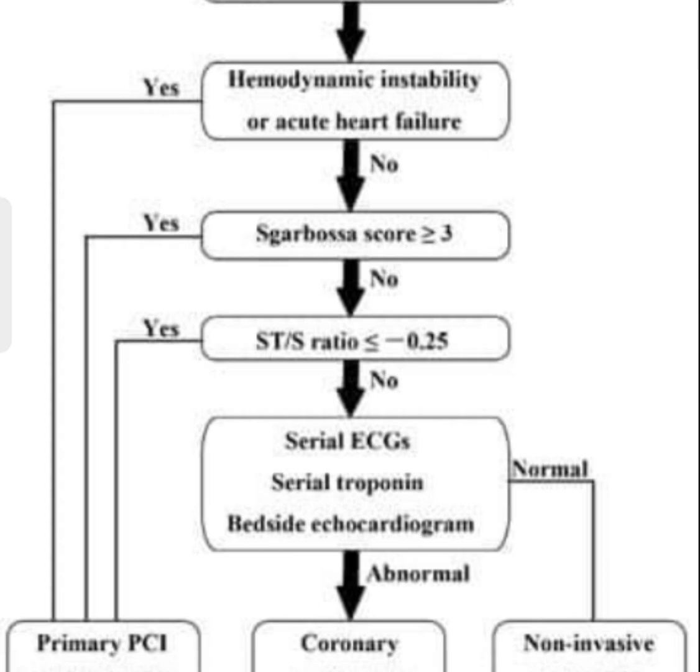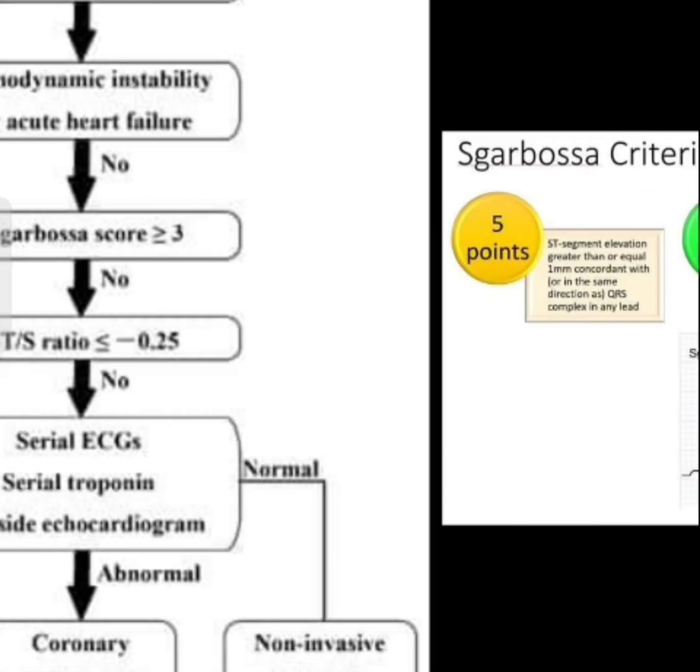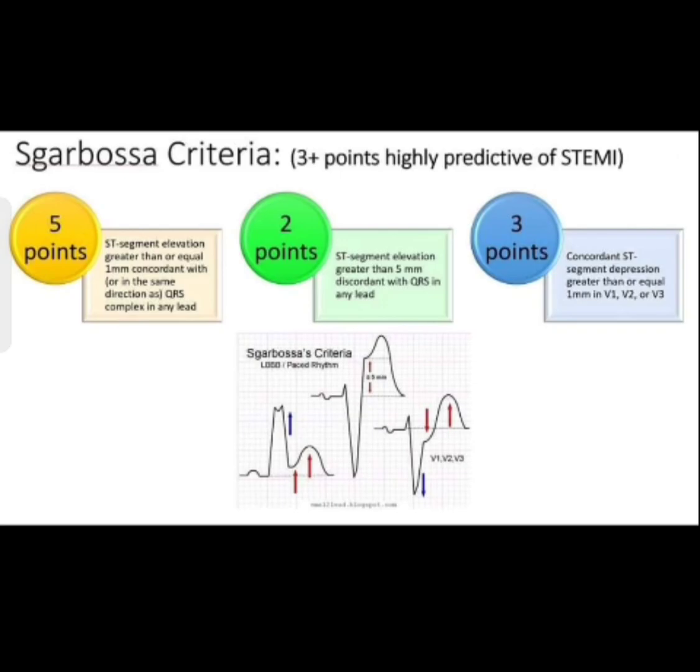If they are abnormal, go for angiography. If they are normal, then you go for non-invasive evaluation. Sgarbossa criteria of 3 or more points are highly predictive of ST elevation MI.